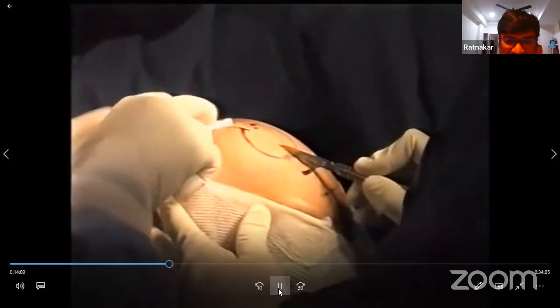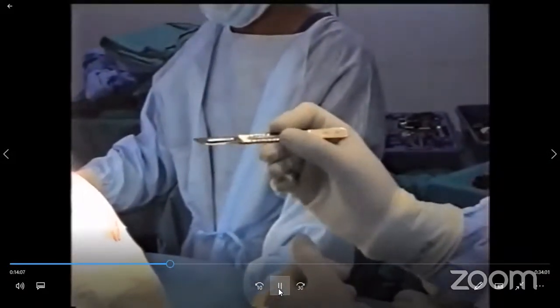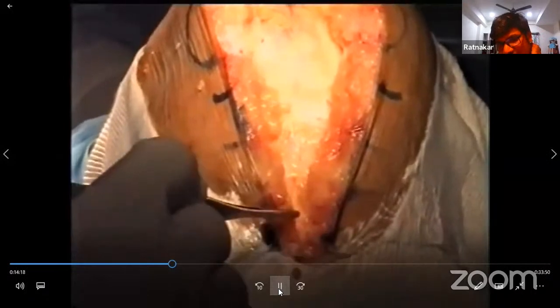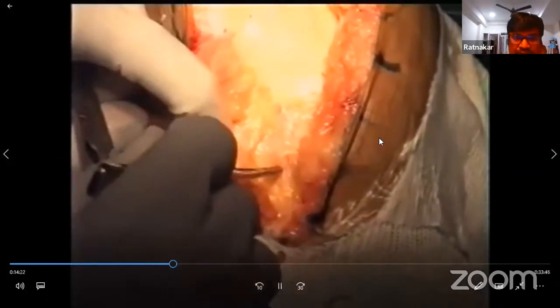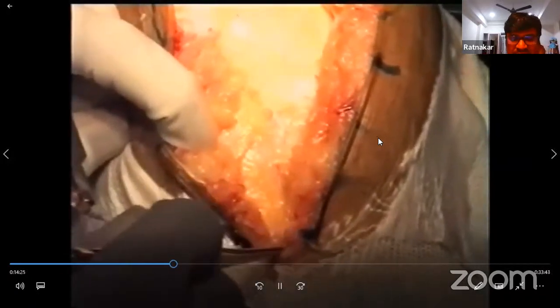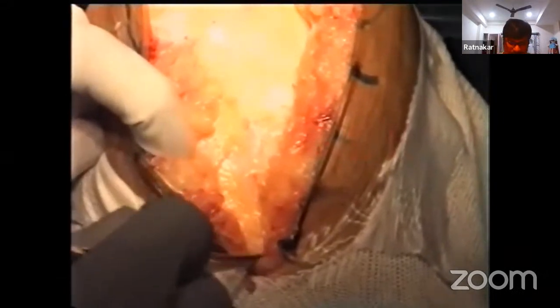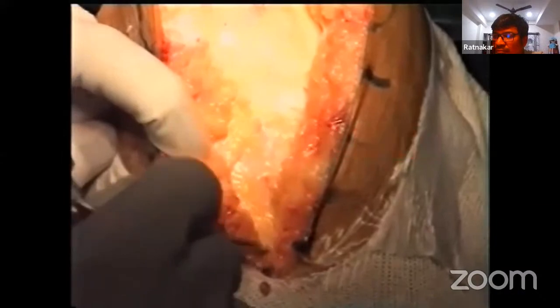I think everyone is clear, right? We can go for the skin incision, and you have to go for the inside knife now. By doing the incision in the flexed position, we can see the cleavage is so clean and very easy. One important tip here is never struggle to see the tibial tuberosity. That is the tibial tuberosity here. Your skin incision should be 1 centimeter more than your tibial tuberosity, because that is the area where skin necrosis can happen. So there should not be any tension here.